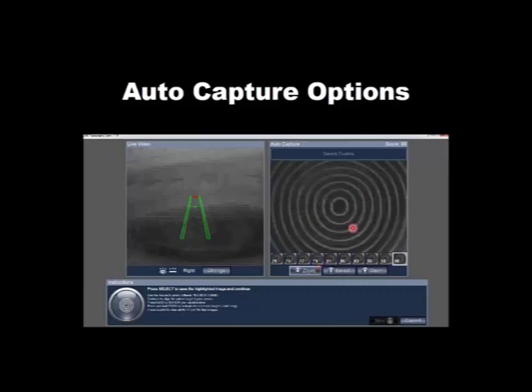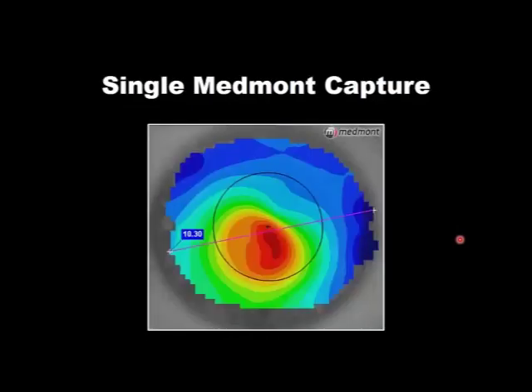We're going to make sure those central rings look parallel and even. Remember that a topographer determines the eye from the center to the periphery. So if the center is poorly understood, if there's lots of tear film breakup, lots of distortion of the rings, that's going to create topographical error. That's going to create construction error in how we determine eye shape, eye elevation, and so on. So make sure you get a 95% or better and then zoom in to ensure those central 10 to 15 rings look ideal.